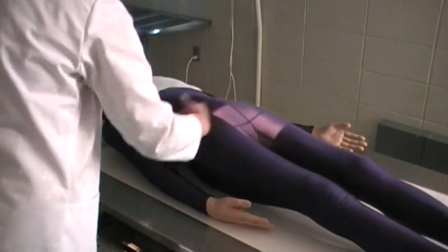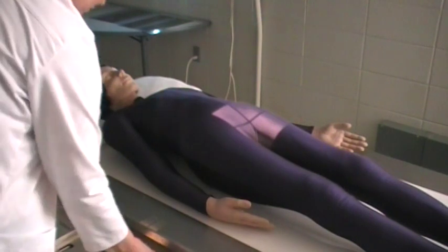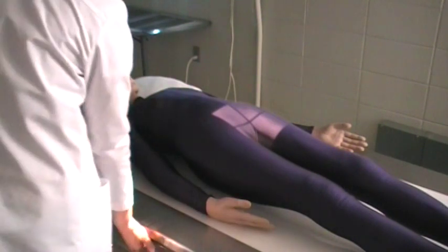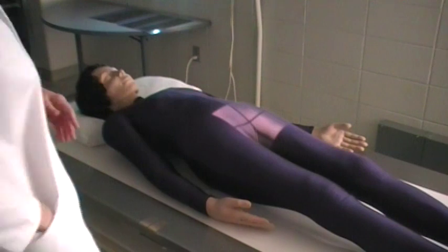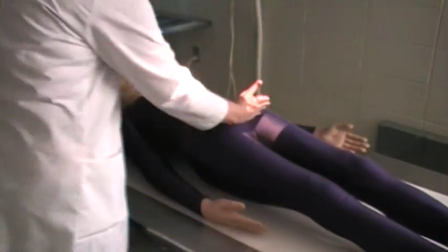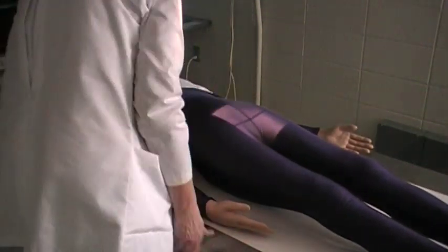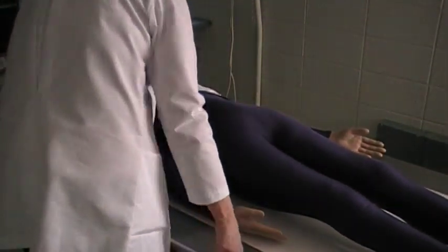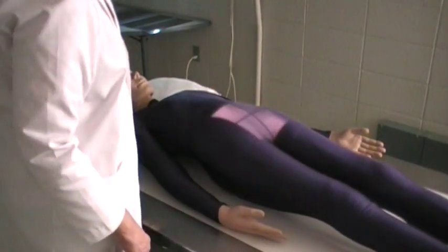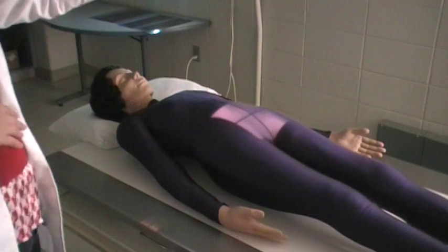I'm going to identify that this is the right side of the patient, so I'm going to place my right marker on the IR. Our central ray is going to enter 2 inches superior to the pubic symphysis. This is our AP axial of the sacrum.